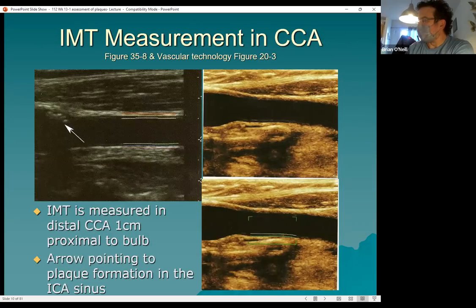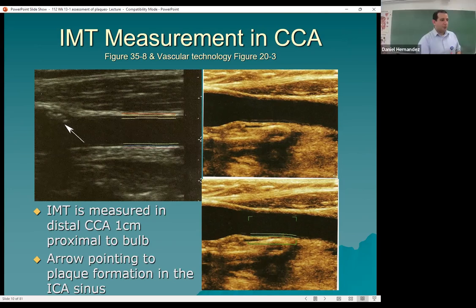And seeing that reflection is going to be common when we're scanning. Yeah, so that intimal layer, we see it. Our goal is to try and see that intimal layer. So you can kind of see the intimal layer here, see the intimal layer here. Okay, got it.